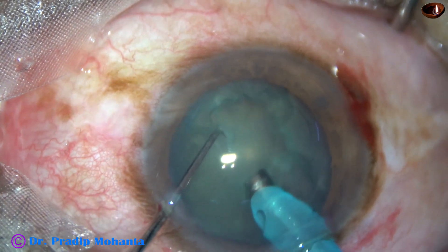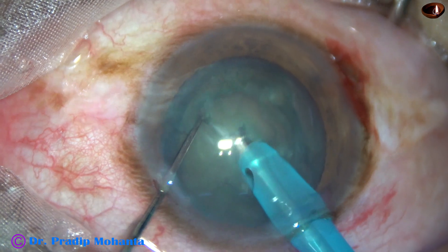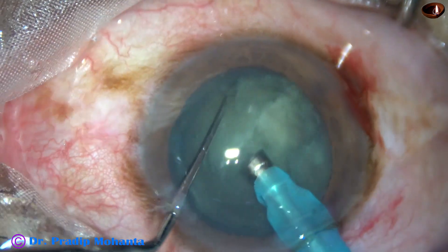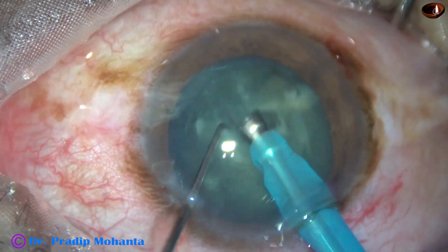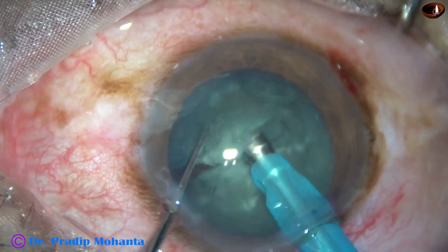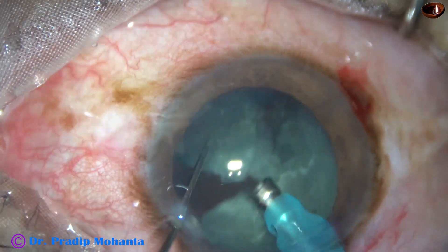This is a real-time surgery. The tip of the phaco handpiece goes into the substance of the nucleus, travels for a distance, and then the nucleus is chopped. This is one hemi-nucleus — it is chopped. Now we come to the other hemi-nucleus; it is also chopped into two pieces.